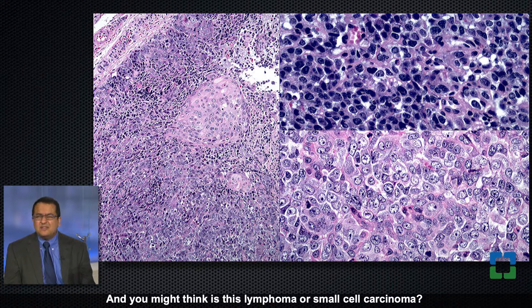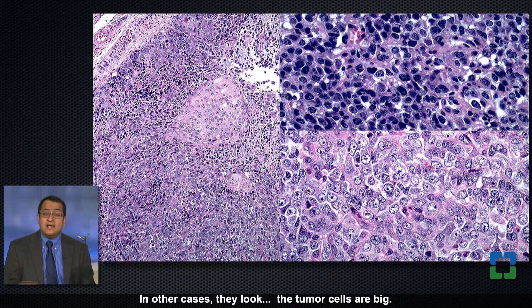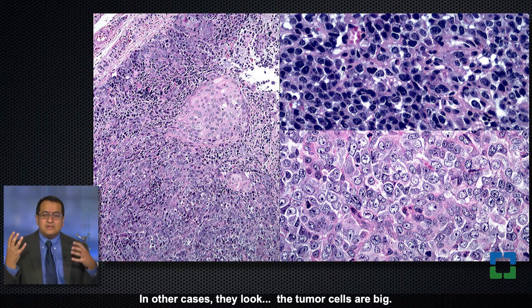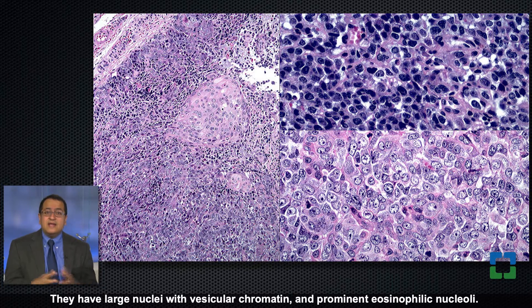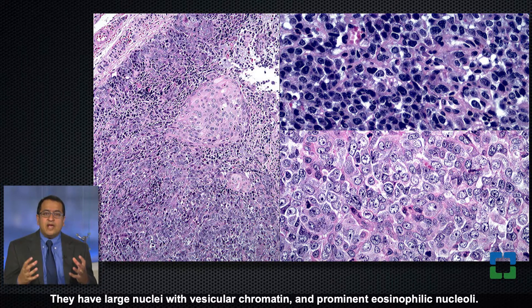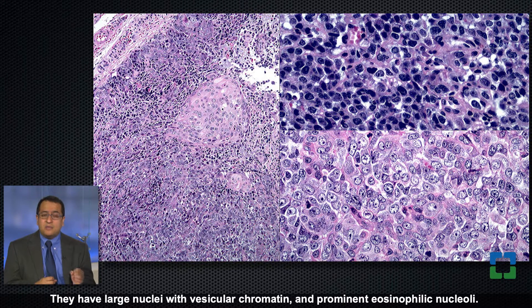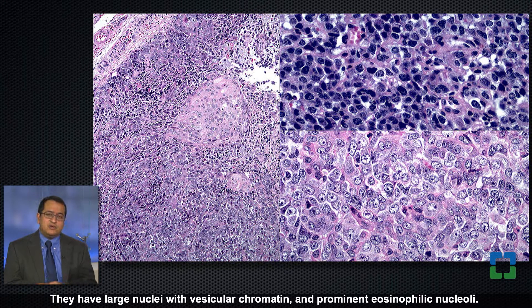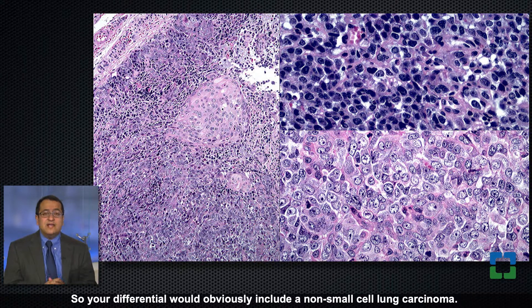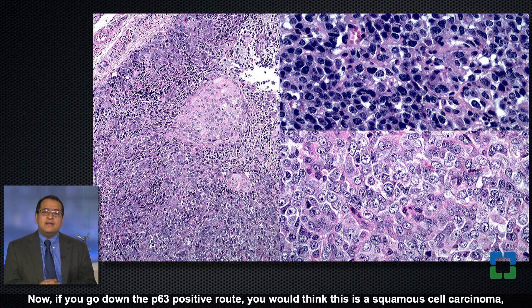You might think: is this lymphoma or small cell carcinoma? In other cases the tumor cells are big, with large nuclei, vesicular chromatin, and prominent eosinophilic nucleoli, so your differential would obviously include a non-small cell lung carcinoma.